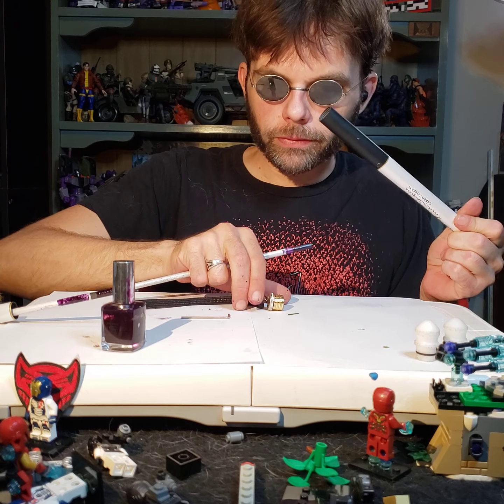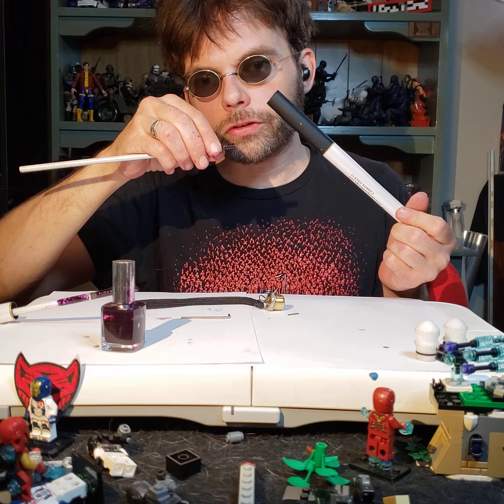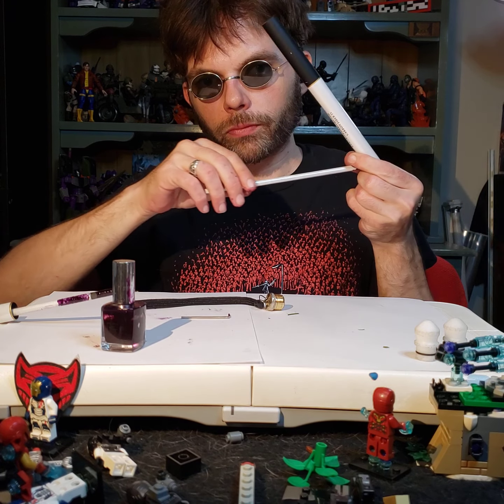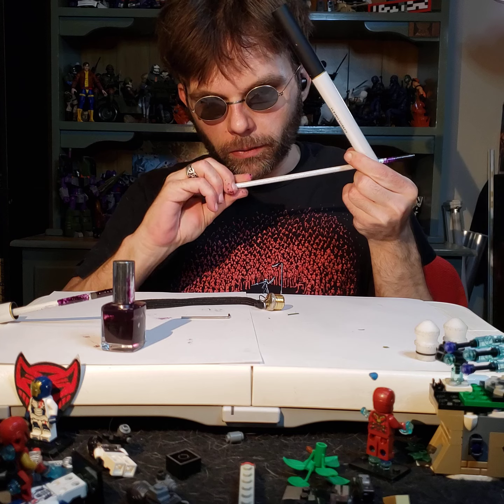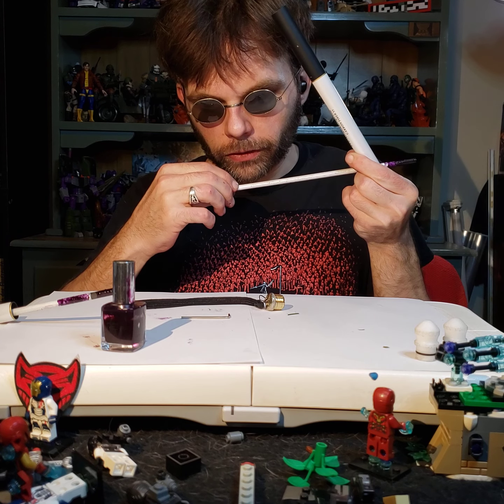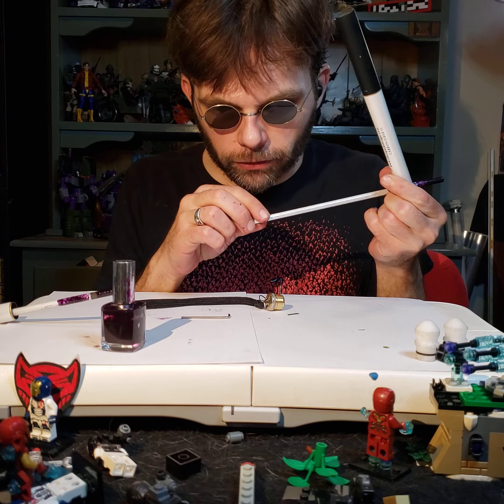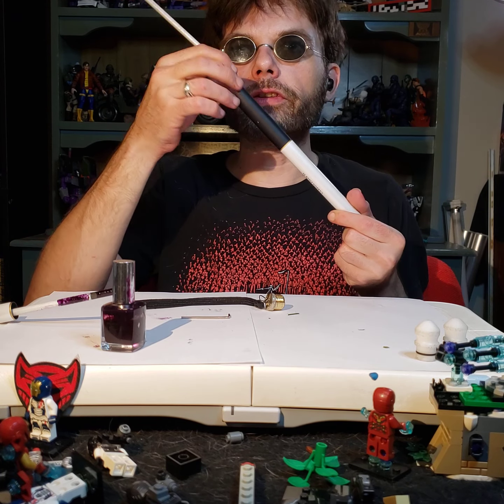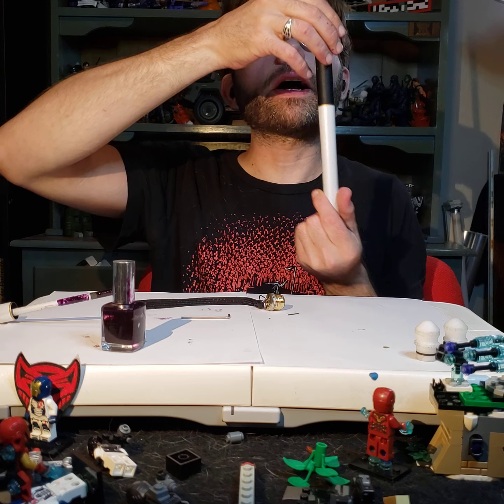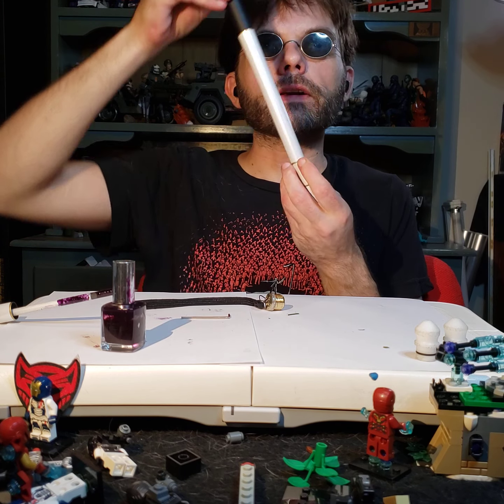Set this down. Now let's go ahead and find the tip that screws into, where's the end that screws into the, there it is. Okay, so I found the screw hole, the little bit where the screw on the tip of your cane has bit into the carbon fiber. It means the other side is the side that I'm trying to stop from breaking. And let's push it in. Let's see how it works.